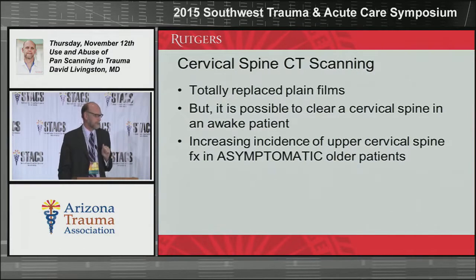Cervical spine, I think I've gone through a fair amount. There is no doubt that CT scanning is, compared to the old days when I used to try to pull the patient's arm to get C7, and they would fight me back, and then you do a swimmer's view, and I was drowning, and they were swimming, and it was just terrible. I mean, you just couldn't see anything. Really, at this point, in this day and age, CT scanning is the preferred modality. There's no doubt about it.